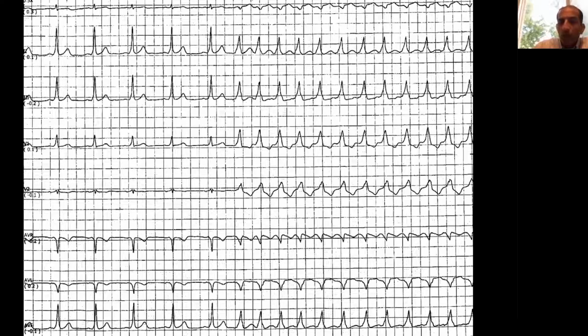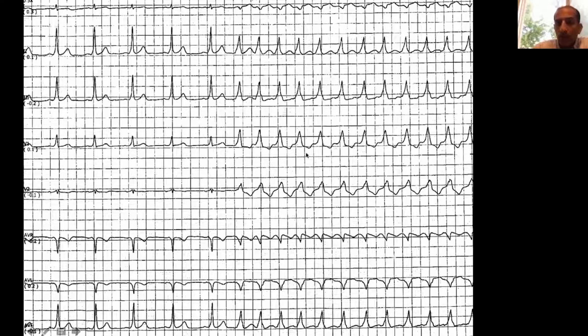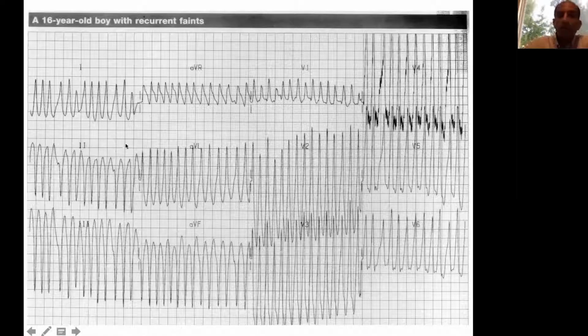The other way they can go into tachycardia is wide complex tachycardia, which is referred to as pre-excited tachycardia. This means that now they are going down the accessory pathway to activate the ventricle totally through the accessory pathway, so they are very wide. Again, I'll show you a cartoon. One of the problems is that if you don't pick this up right or treat it the wrong way, they can go from this to very fast ventricular tachycardia, and then they can die from that. So you really have to be very careful in these patients.